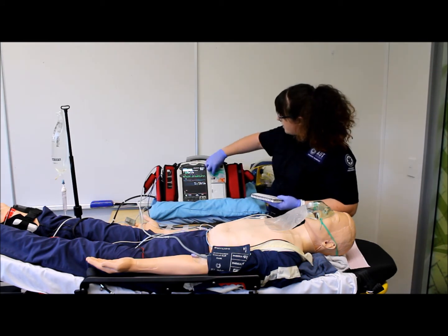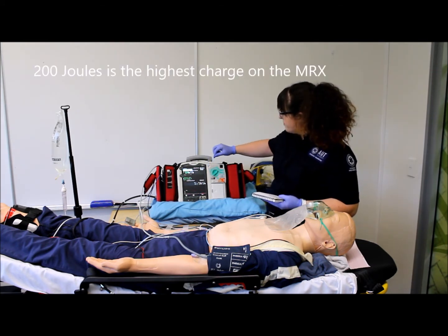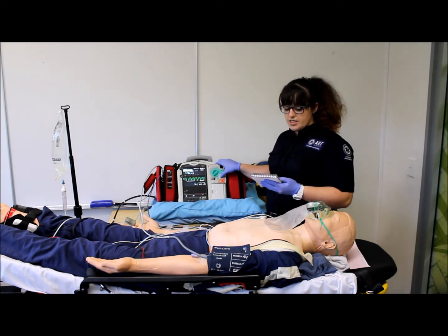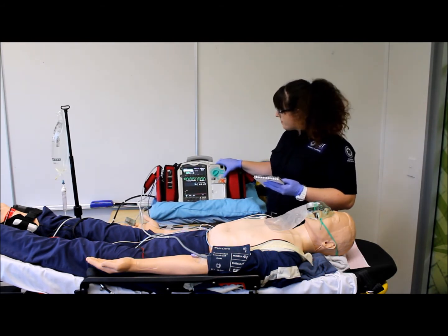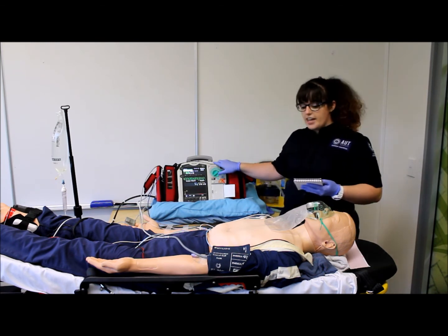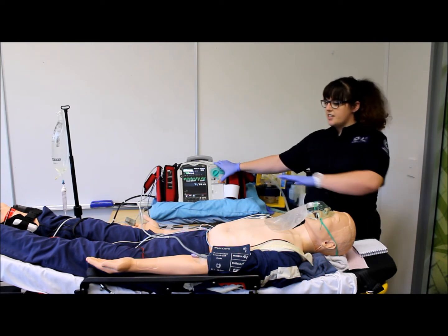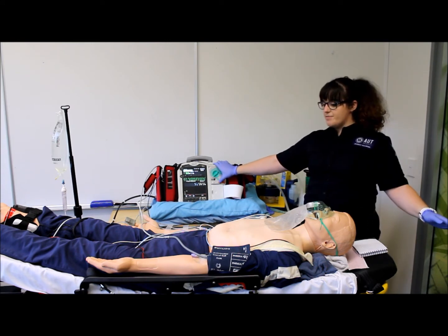We are going to turn our monitor to 200 joules. We are going to press charge. And when that's ready, we're going to clear our patient. Shocking now.